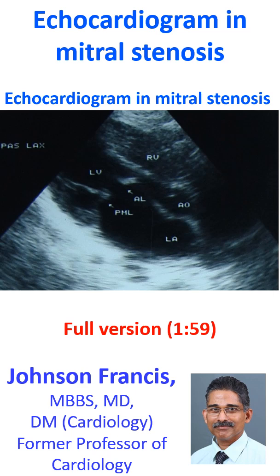Parasternal long axis view showing dilated left atrium, thickened and paradoxically moving — i.e., anteriorly in diastole — posterior mitral leaflet and doming anterior mitral leaflet. The movement abnormalities of the mitral leaflets are due to commissural fusion.